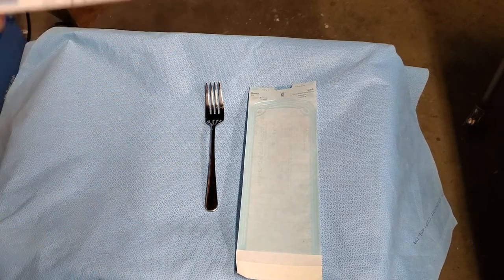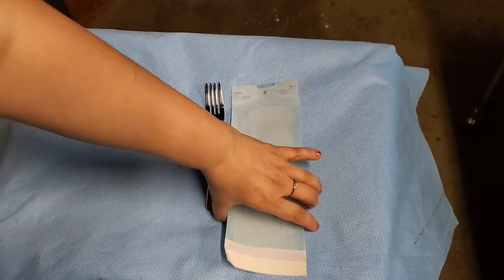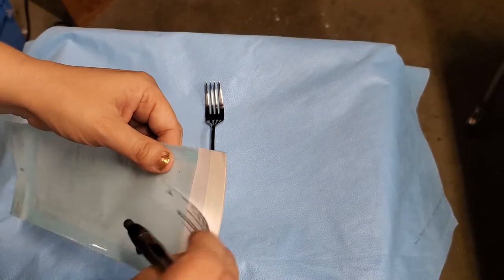On here we need to put the date that we are autoclaving and then your initials. So my initials and today's date. This goes in here that lets me know that the inside of this is going to be sterilized, not just the packet itself.